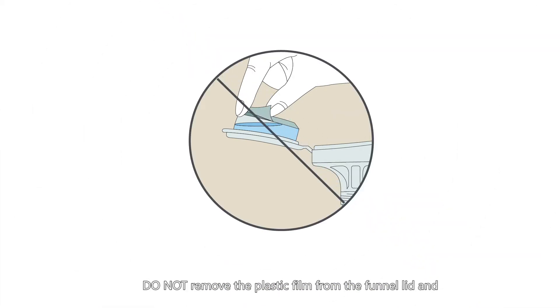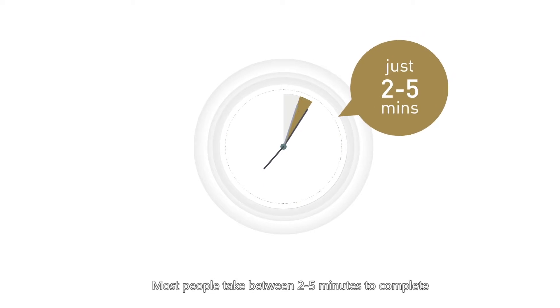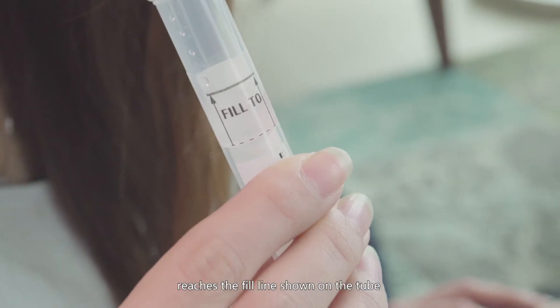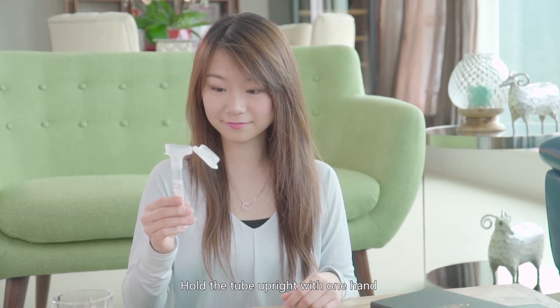Before sample collection, do not remove the plastic film from the funnel lid and do not close the funnel lid before sample collection is completed. Most people take between 2 to 5 minutes to complete the sample collection process. Spit into the funnel until the amount of liquid saliva — not bubbles — reaches the fill line shown on the tube. Hold the tube upright with one hand.